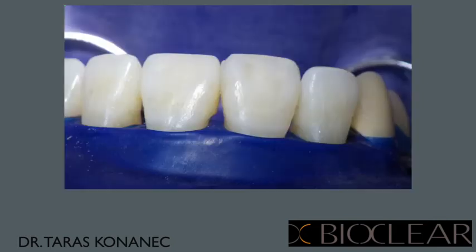Here is the first step in the procedure. We always take the time to isolate and place this plastic over the teeth. This plastic is meant to keep the tooth dry so that we can achieve perfect bonding to the tooth of the Bioclear resin. Here you can see in this case, as we were starting to close this black triangle, we had a failed attempt of bonding from a previous treatment. With the Bioclear system, we're going to be able to extend this right down to just underneath the gum and come out with a really nice natural contour.